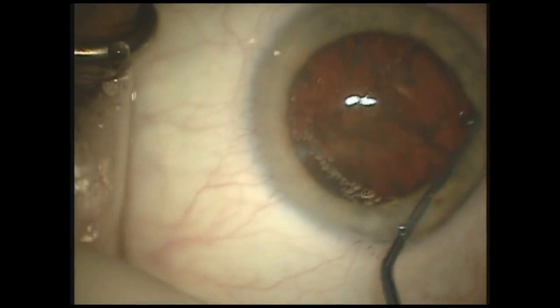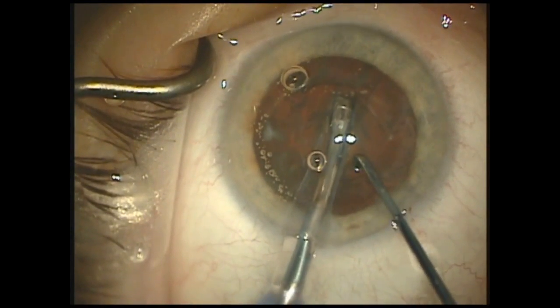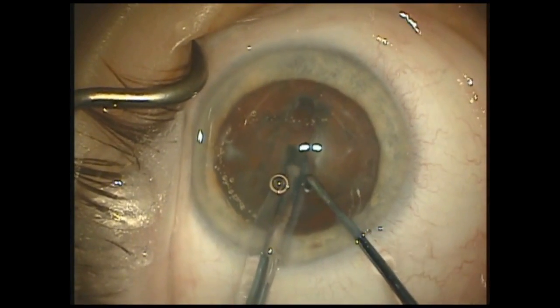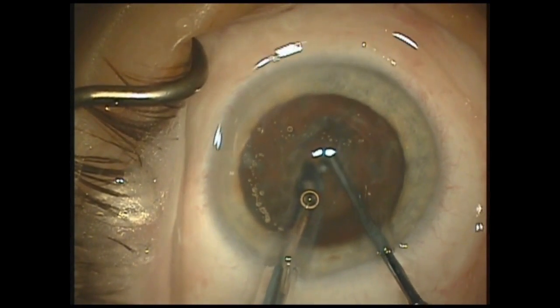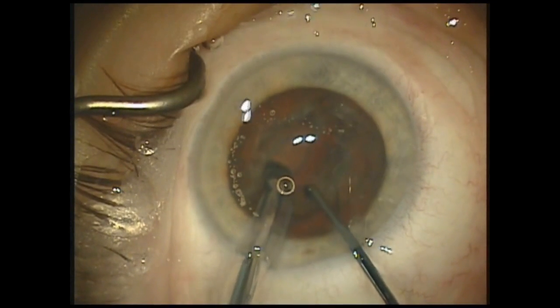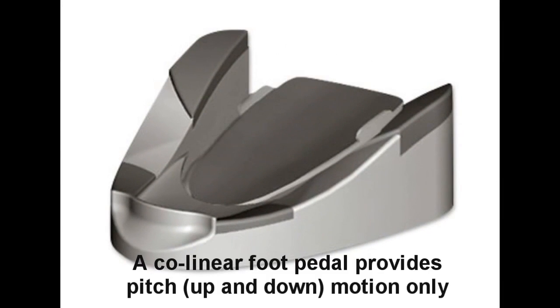I'm going to use a stop and chop technique, and I'll be using the dual linear foot pedal for greater control throughout the case. I've already preset the maximum vacuum levels in the pitch position to help prevent surge like we saw in the last case, but I'm going to have the option to increase vacuum on demand by utilizing the yaw or lateral position on the foot pedal at my pre-selected vacuum of 100.